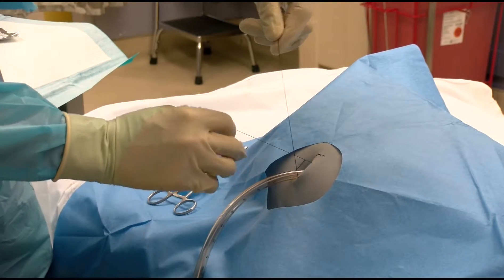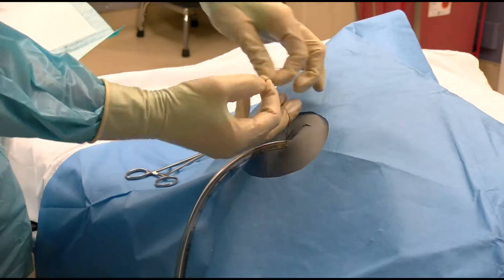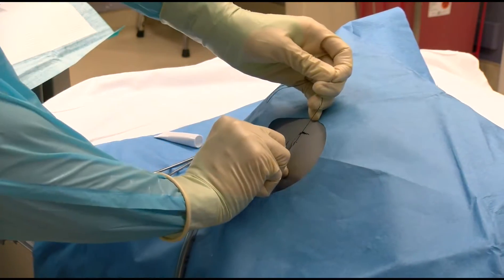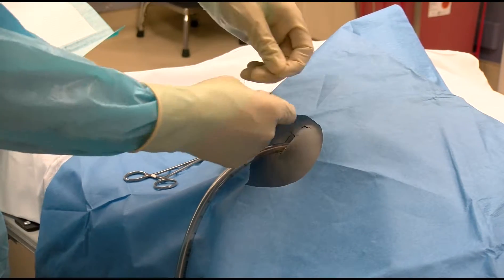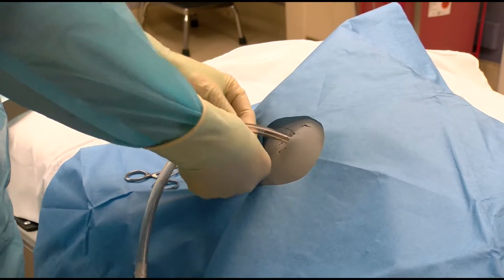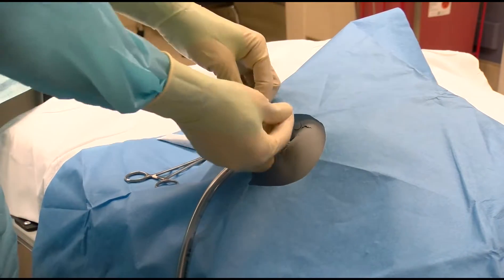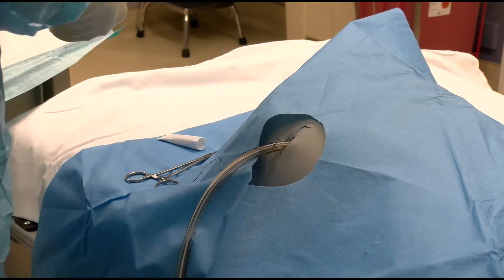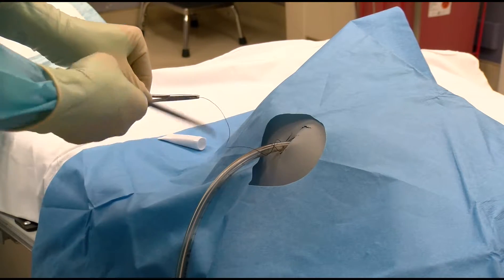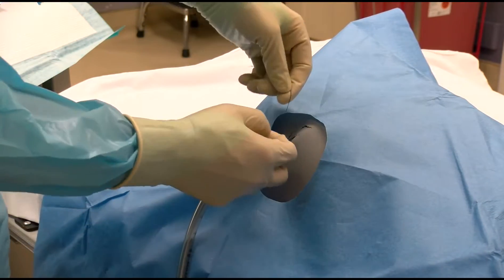Pull the two ends of the suture to equal length and remove the needle from the field. Tie the suture in place tight to the skin. Now wrap the ends in opposite directions around the tube to form a series of X's. This is often described as a Roman sandal or Chinese finger trap configuration. Be sure to push the suture down to the skin edge before tying the suture again to prevent slack from being incorporated into the suture.